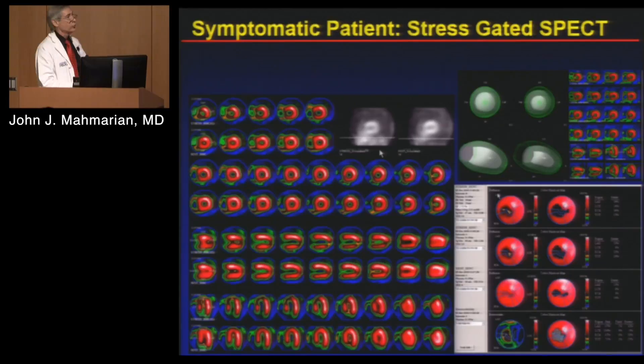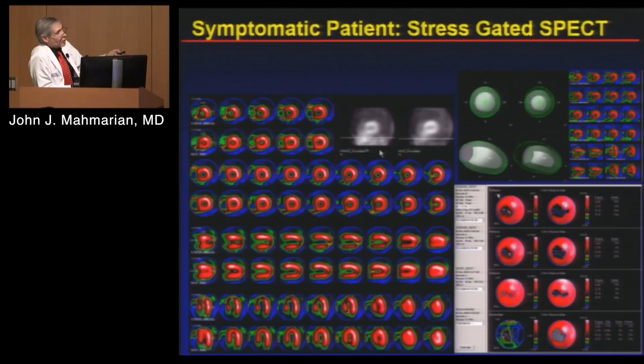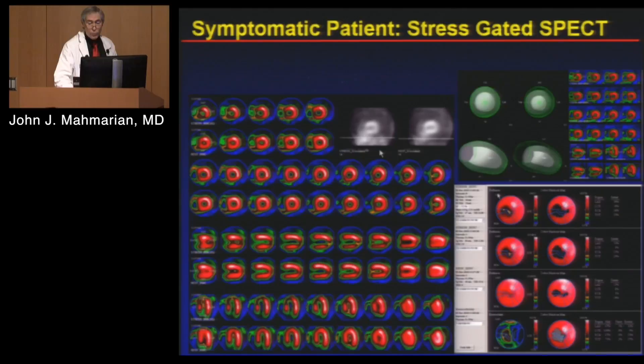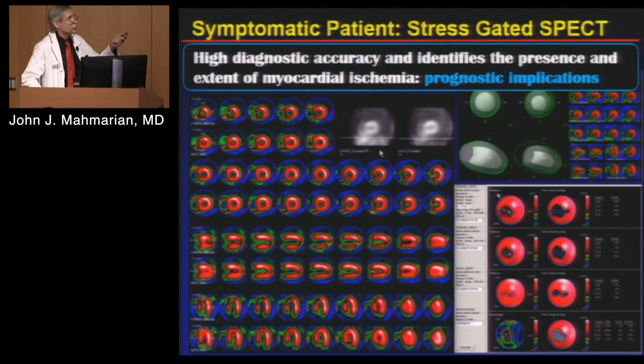Looking at images: a patient with a stress myocardial perfusion scan shows a defect in the septum on stress images that gets better on rest images. We can look at wall motion using gated SPECT in terms of ejection fraction, and we can quantify defects. This patient has approximately a 20% ischemic defect as shown on the polar maps. Putting everything together — looking at images, diagnosing coronary disease, identifying the presence and extent of ischemia — clearly has prognostic implications.